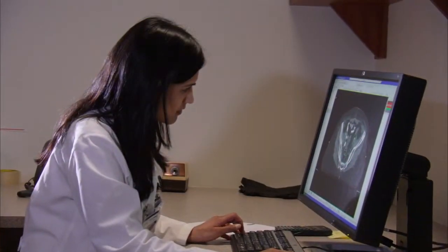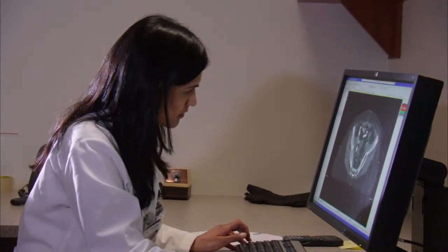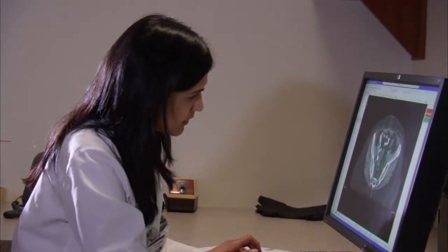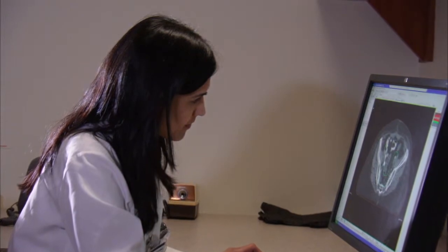After your consultation visit, your physician needs to verify the exact size, shape, and location of your tumor so that your precise radiation treatment can be planned. After a patient is seen in consultation, if it's been determined that he or she would benefit from radiation therapy, the first step is what we call a CT simulation. That's where we send the patient to our CAT scan machine and obtain a mapping scan, basically a CAT scan through the area of interest where the tumor lies.